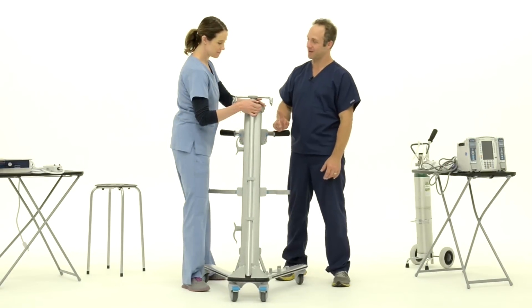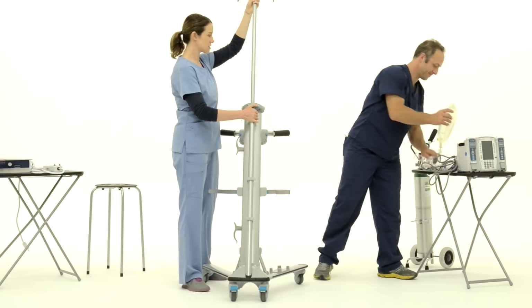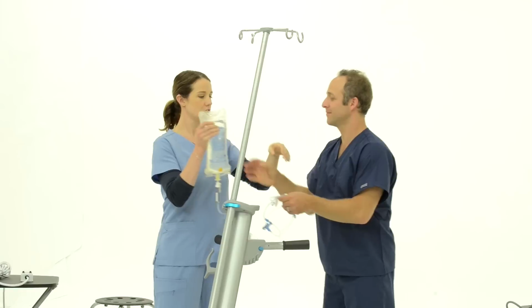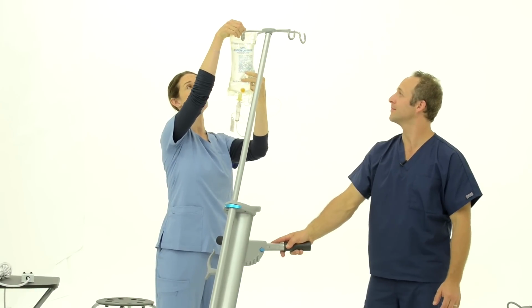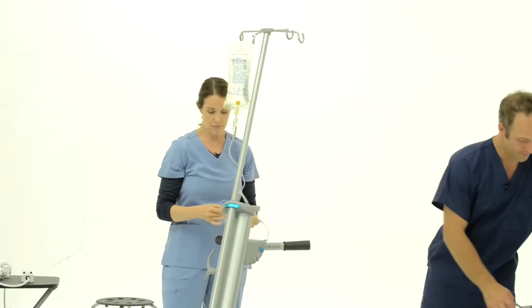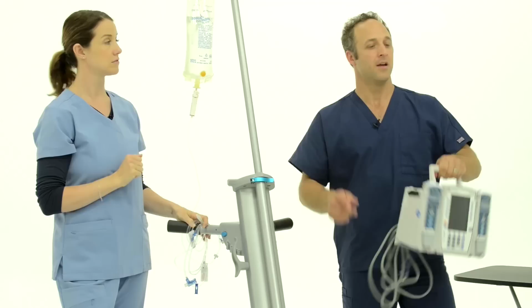So for infusion, the IV hooks raise and lower using this quick release. With today's pumps, you really don't need to raise them, and really it's best to keep them down. But if you do raise them, make sure that you lower them before you ambulate a patient to keep the field of vision clear. Your infusion pump mounts here.